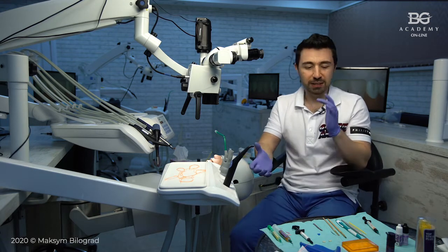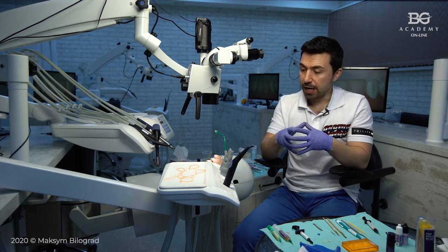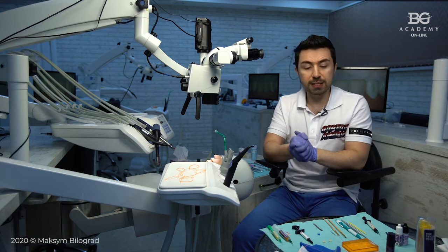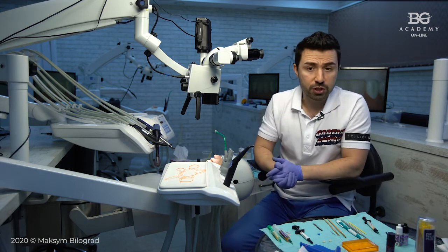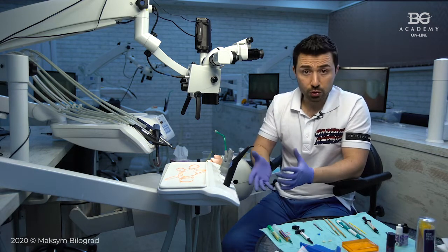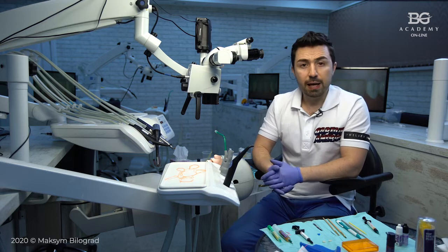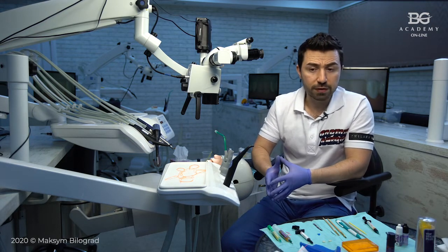Okay, so we had a lot of responses and a lot of requests from your side, guys, to make this type of webinar about veneer bonding, because you know that previously we have several episodes of online masterclasses about veneer preparations. We did technical aspects of veneer preparations.